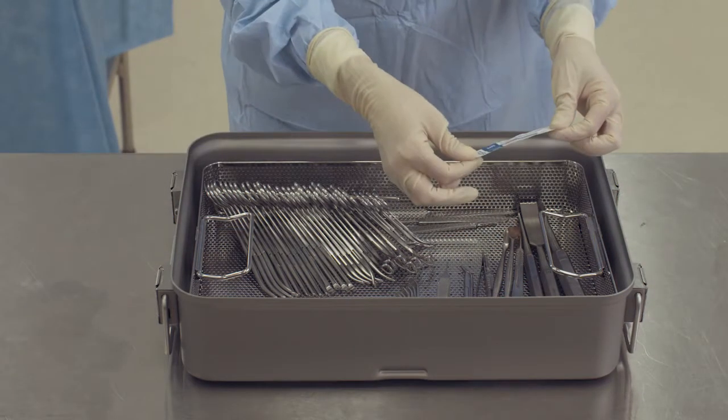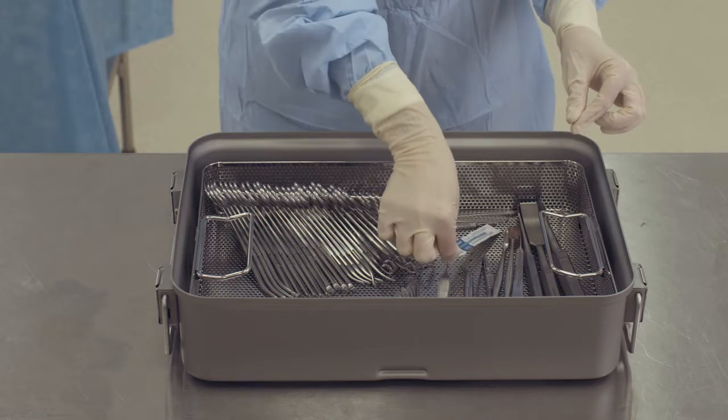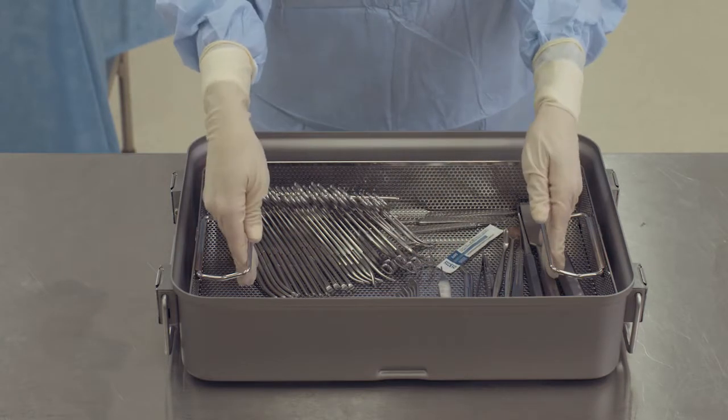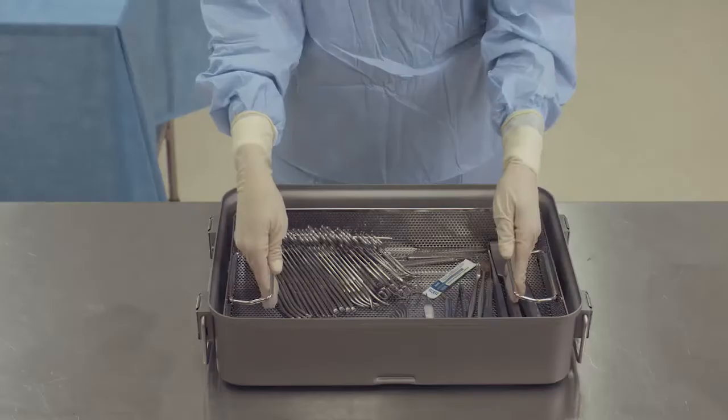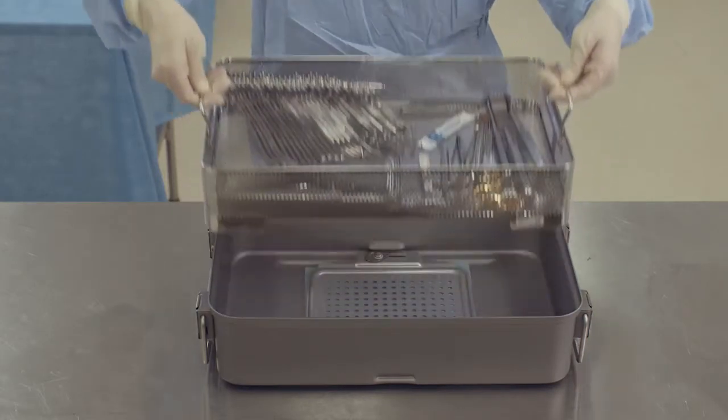Check the internal chemical indicator for acceptable results. Securely grasp the basket handles, making sure the sterile gown and gloves do not touch the outside of the container, the container edge or table. Lift the basket in a straight upward direction.